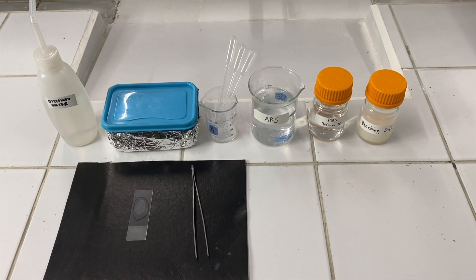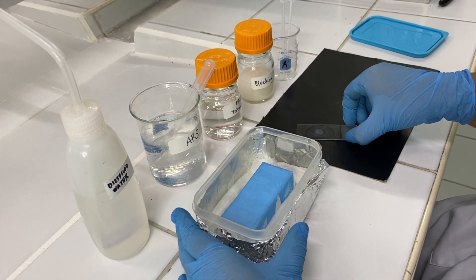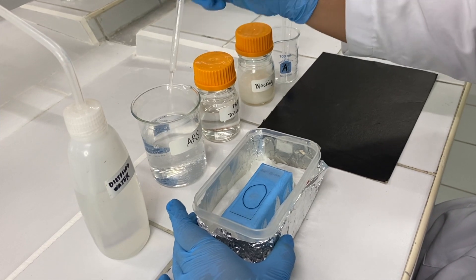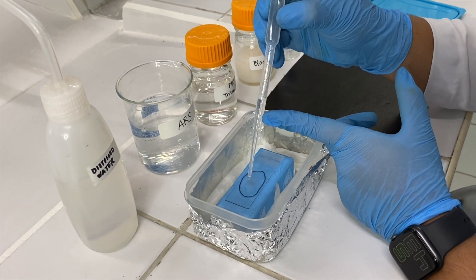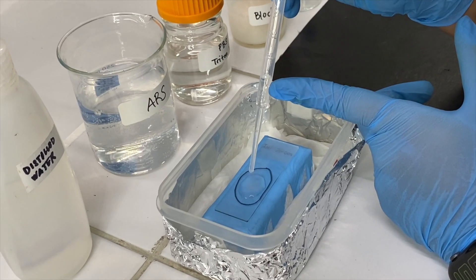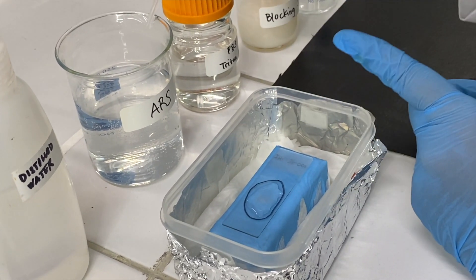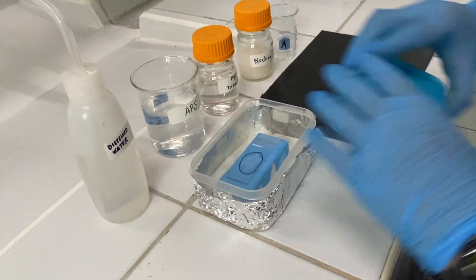Once everything is ready, we can now proceed with the antigen retrieval step. First, we apply the warm antigen retrieval solution on the tissue section. Ensure that the entire specimen is covered with the solution, and incubate it inside the chamber for 7 minutes at room temperature.